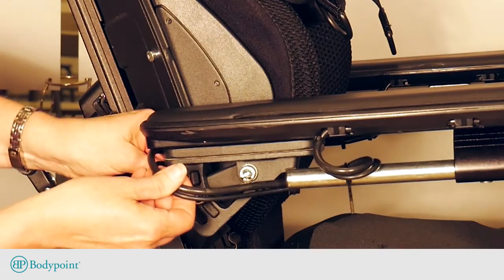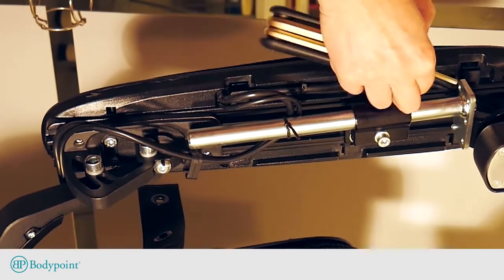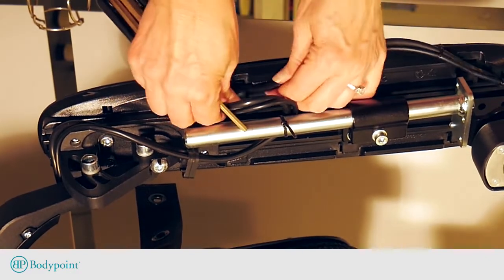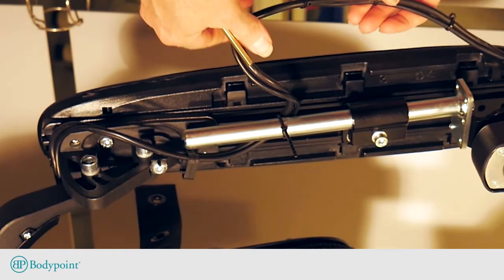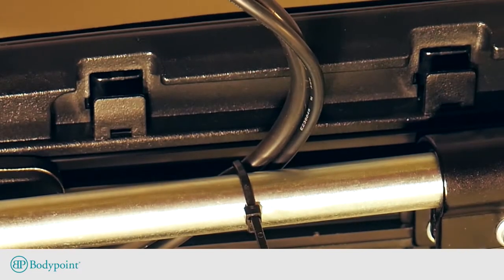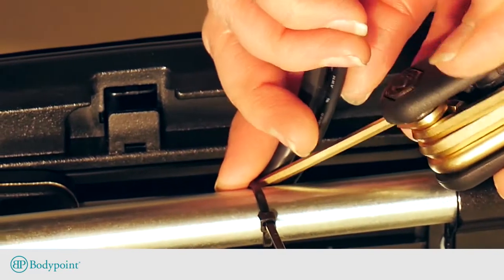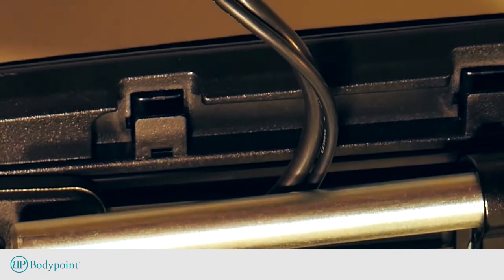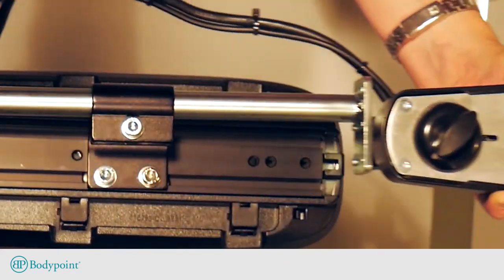Loosen the joystick wires from the mounting bracket and armrest. Push the plastic tabs below the armrest inwards to unsnap them and loosen the wires. To remove the existing zip ties safely without using a knife, which could damage the wire's insulation, pass a hex key or Allen wrench through the zip tie and twist to break it. Remove the original joystick mounting bracket and clamp.